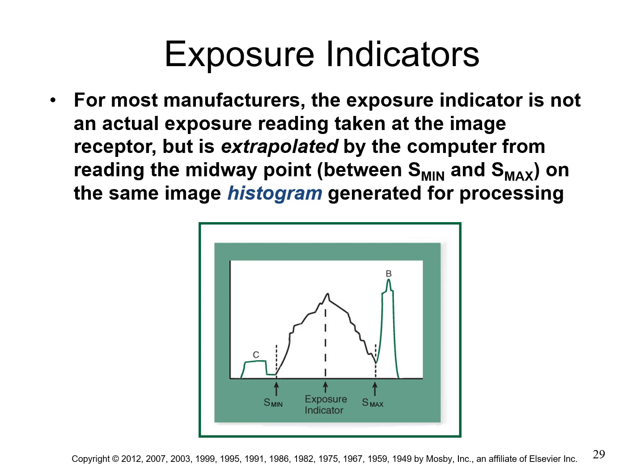That's jet black. In the middle are the in-between colors between metal content, C, bright white, and raw primary radiation, jet black, at B. Anatomy usually doesn't present as completely pure white or completely pure black. And so your anatomic range, your useful peak, is in the middle of the two peaks, and that's how you read the histogram. The midpoint value, that's typically the exposure indicator.